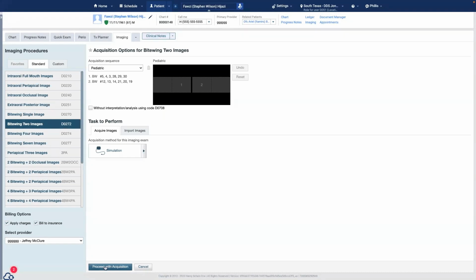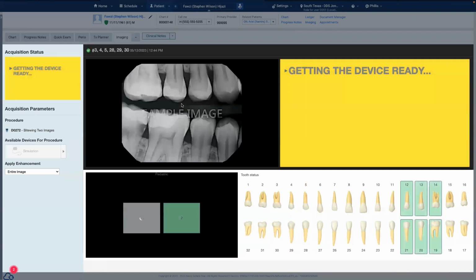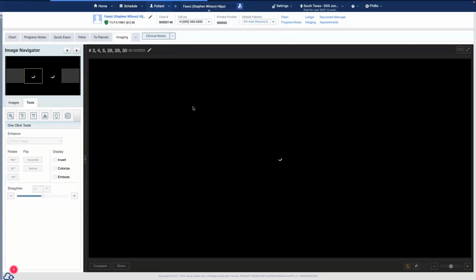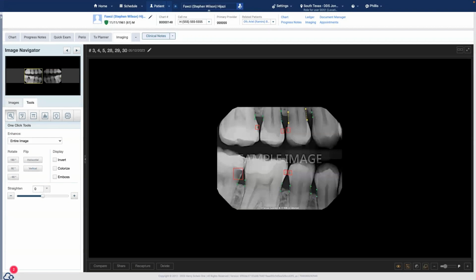So it's very comprehensive as far as imaging software. I always talk about this, that a lot of cloud companies are great at creating software, but doing imaging is different. Only a handful, in my opinion, can do it. And in my opinion, Dentrix Ascend has the best imaging out there, and everybody knows how I feel about it. Yeah, to your point, practice management in the cloud, there's some great solutions on the market. Obviously, I have my opinion with Dentrix Ascend, but when it comes to imaging, we really care about those clinical tools. For us, this is a big deal, how we do our imaging.